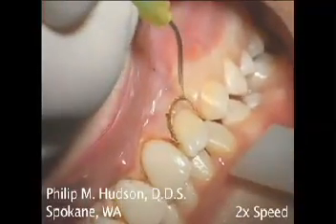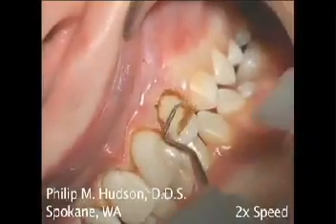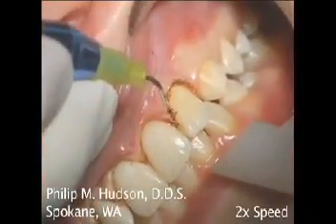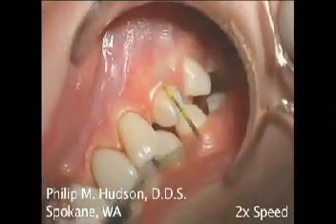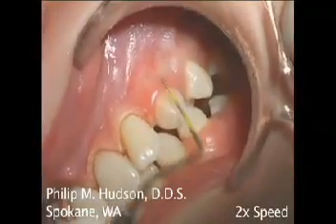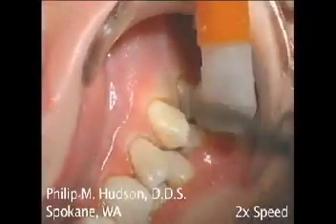3. At normal operating parameters, the laser will not cause recession, nor will there be rebound. Tissues will appear normal in 7 to 10 days. 4. Monitor with a periodontal probe on each tooth the amount of tissue that may be removed without biologic width violations.